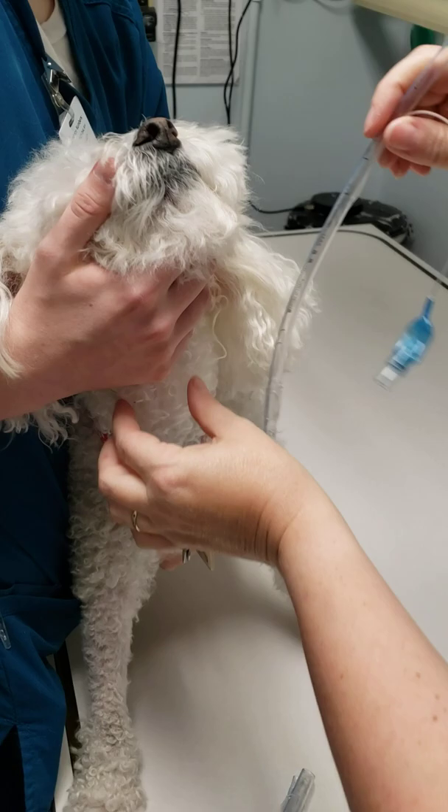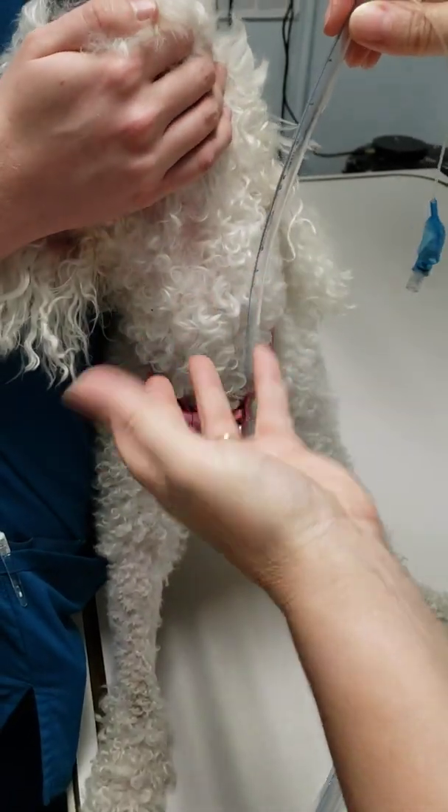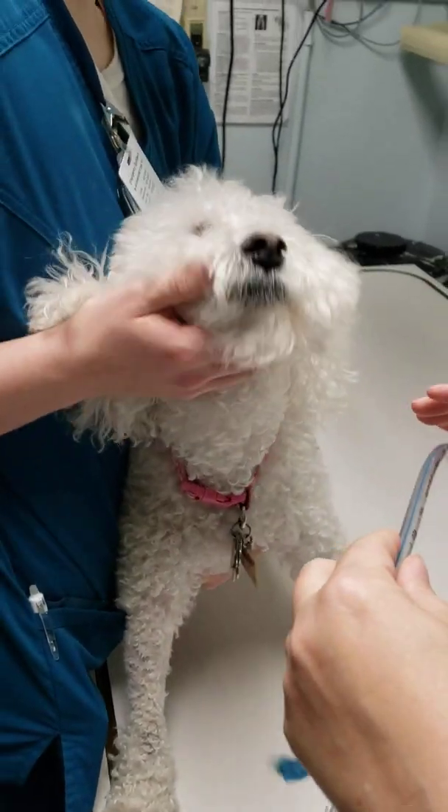The other way is you're going to palpate the trachea. This one's a little harder to do. She's a nice size — not too fat, not too thin — you can feel very easily. But on larger animals, sometimes it's hard to actually palpate that.